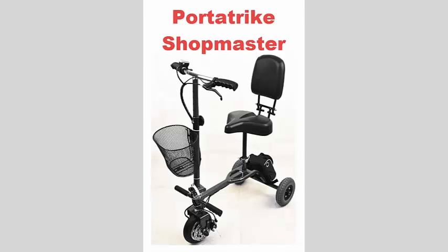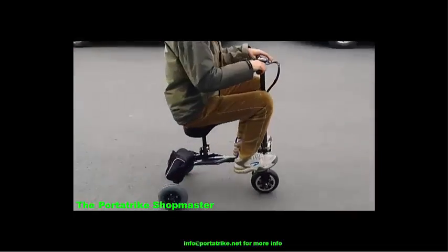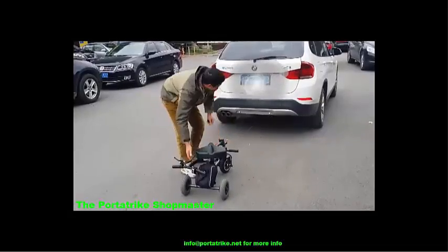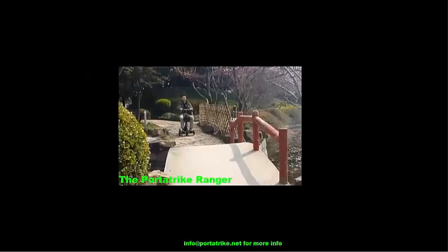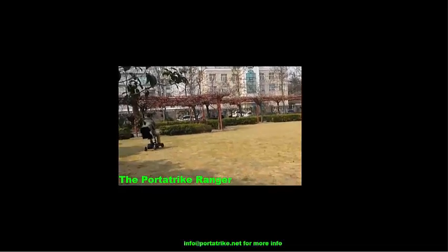Next we move to our mobility scooters, starting with the PortaTrike Shopmaster — a highly portable 3-wheel electric scooter weighing only 14kg, designed for passengers up to 100kg or 220lbs over flat areas and inclines of up to 8 degrees. Should you need capacity for passengers up to 120kg or 264lbs along with patent pending anti-tip wheels for greatly increased safety, I would recommend the PortaTrike Ranger. It is slightly heavier but still highly portable and comes with a comfortable folding padded chair as opposed to a large saddle for extra comfort.